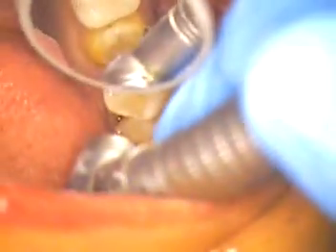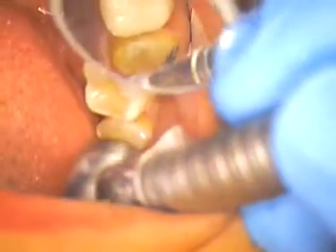All right, now we got to do the buckle, so we'll put a new triangle in. We'll take the old one out with water. Okay, so we want to make sure we're protecting her lips. So I'm going to reposition this a little bit higher. Make sure her lips are all protected. And we can zoom back to where we were. All right, here we go.